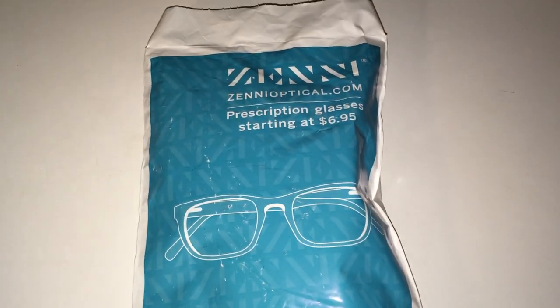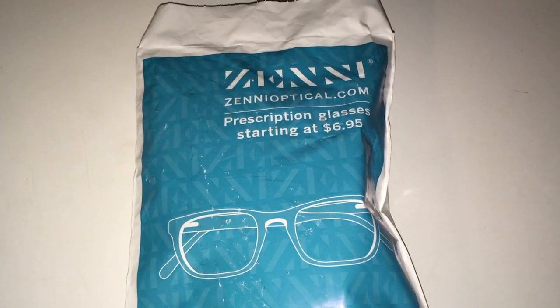What is up people? So today we're gonna be checking out some new eyeglasses from Zenni.